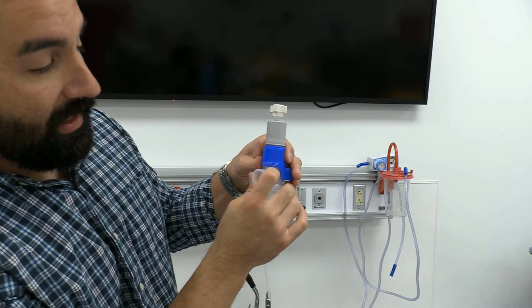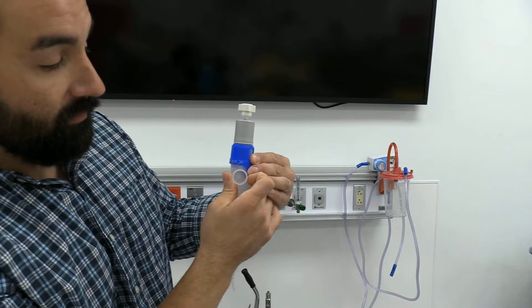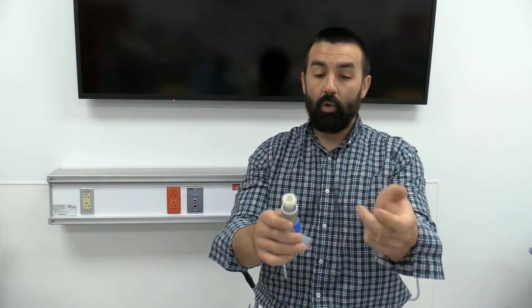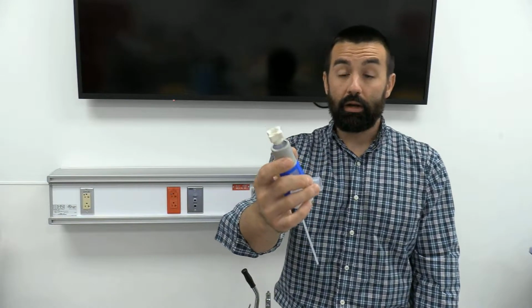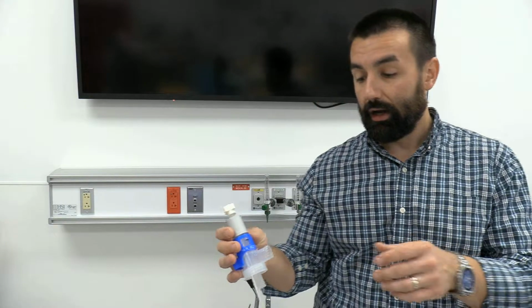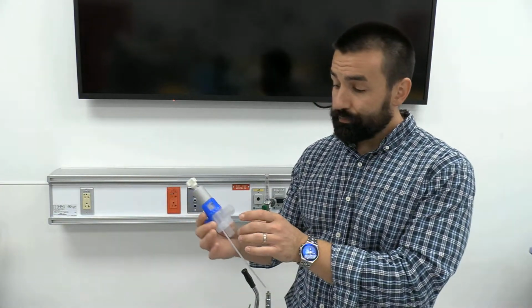Now this one's misleading. It goes all the way up to 70 and 100%, which we know there's gonna be some problems with if you start thinking about air entrainment and the problems we have with those higher FiO2s. We've got a DISS connector here that's gonna thread onto our flow meter. Generally medical oxygen, but there are times where we use medical air, when our patient doesn't need O2.